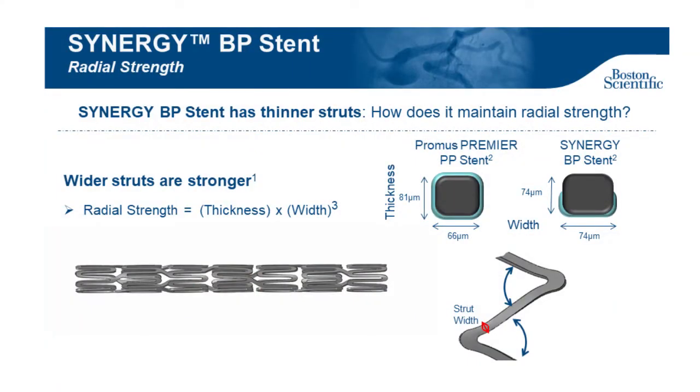Why is this important? If you look at a very simplified engineering equation in the upper left corner, you will see that radial strength in a very simplified manner is strut thickness times strut width to the third power. So a small change in strut width is much more impactful than a change in strut thickness.